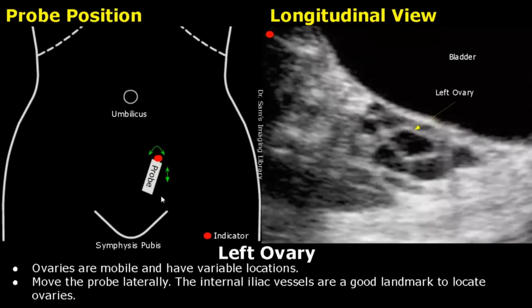In a similar way, move towards the left side to scan the left ovary in longitudinal plane. We will get this type of image. This is the left ovary.